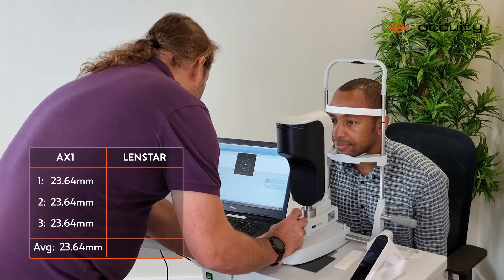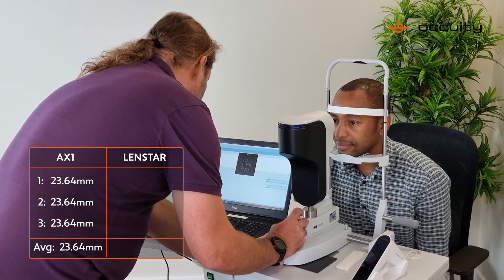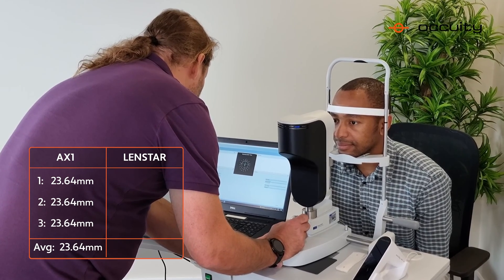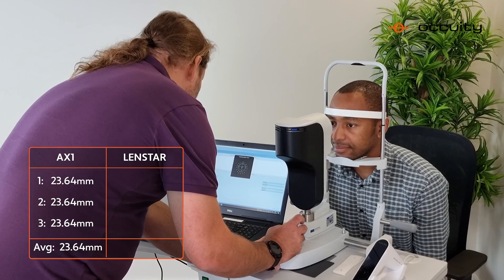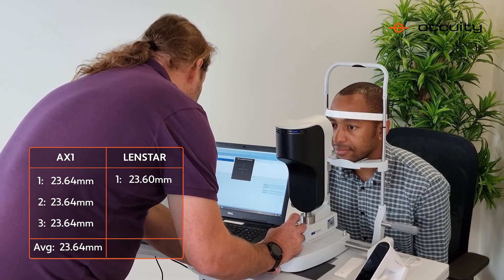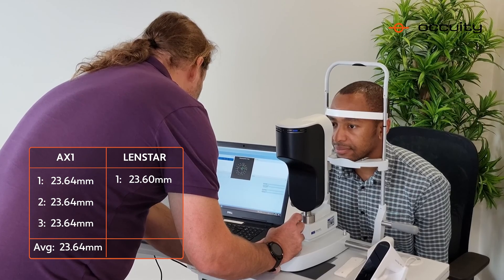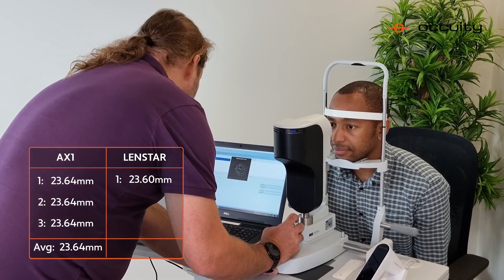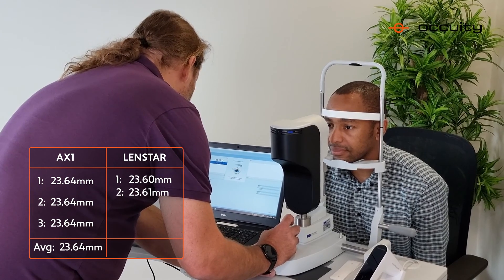The Lensstar takes an average of five measurements. I'll take the first measurement — that's 23.6mm. Second measurement is 23.61mm.